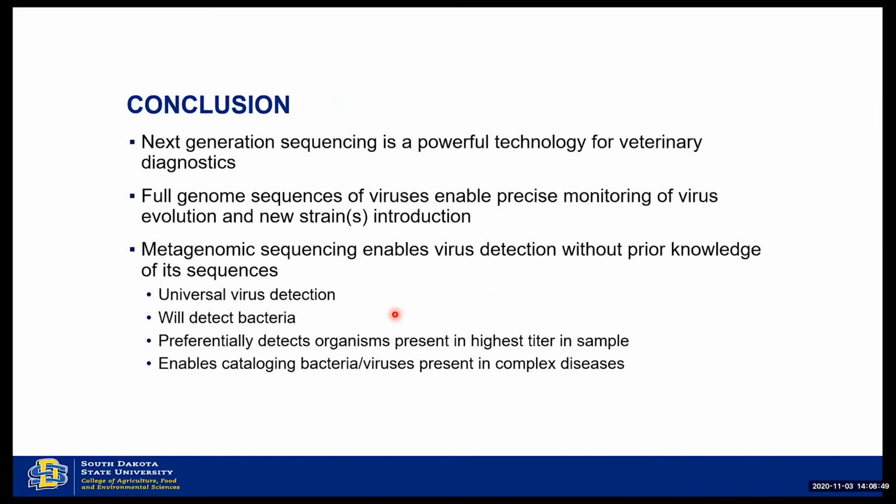I don't need to ask the question, is it positive for PRRS or PCV2? I can just ask the question, what's there?